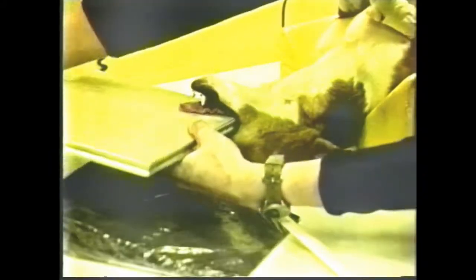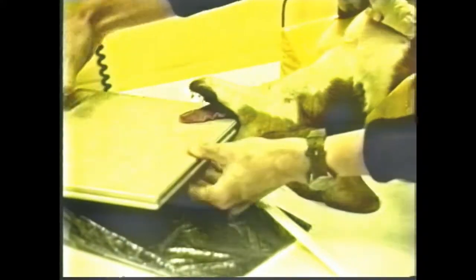Regular cassettes with screens can also be used, particularly in some of the larger breeds. These screens allow a much reduced exposure, which is beneficial to personnel safety. The large cassette is more difficult to get back into the mouth, so you may be limited in the part of the anatomy that can be visualized using regular cassettes.